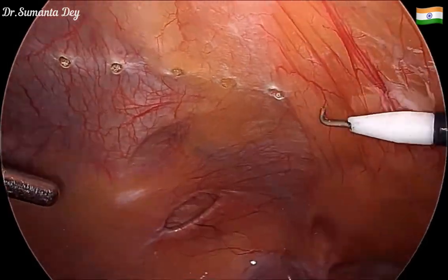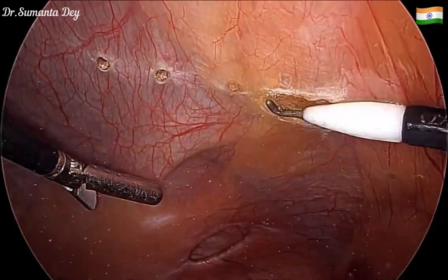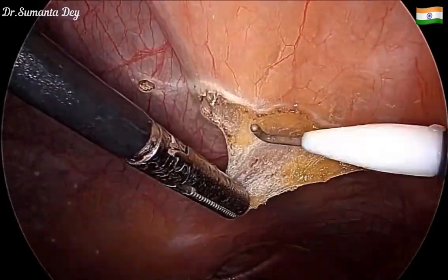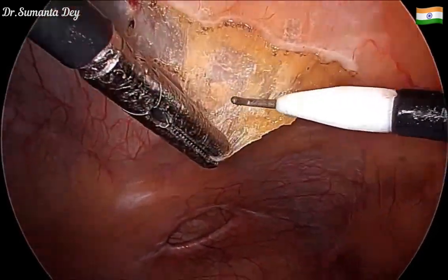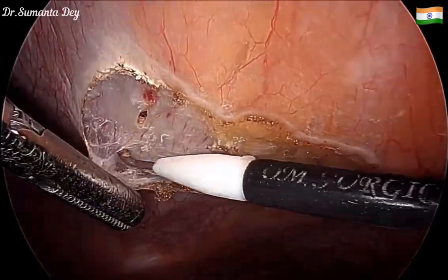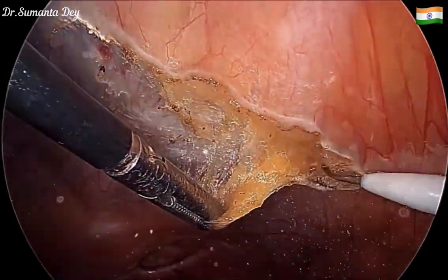After placing the port and with head-down, left-side-up position, I started raising the flap at least five centimeters proximal to the defect margin. Using the hook with monopolar cautery, I am raising the peritoneum and also the preperitoneal fat, grazing along the posterior rectus sheath.